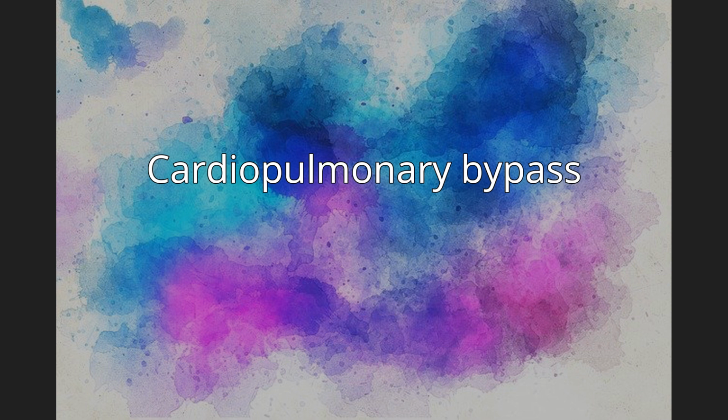During the procedure, hypothermia may be maintained. Body temperature is usually kept at 28 deg C to 32 deg C, 82.4 to 89.6 deg F. The blood is cooled during CPB and returned to the body. The cooled blood slows the body's basal metabolic rate, decreasing its demand for oxygen. Cooled blood usually has a higher viscosity, but the crystalloid solution used to prime the bypass tubing dilutes the blood.